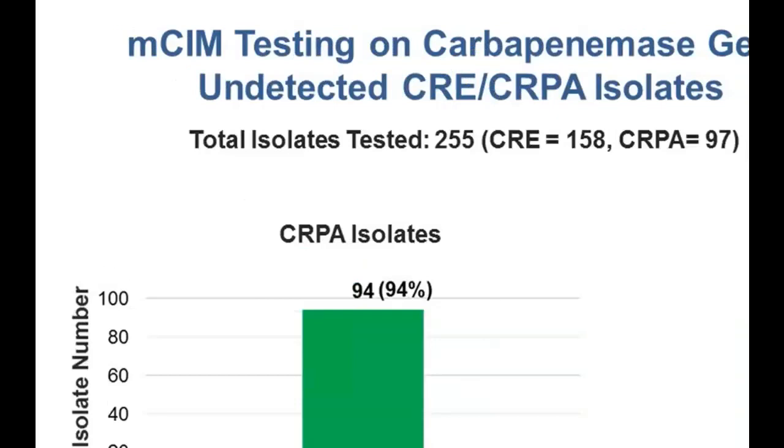And again, the alert for the discordant result was sent to CDC, and this isolate was submitted to Washington Regional Lab or CDC for further testing.